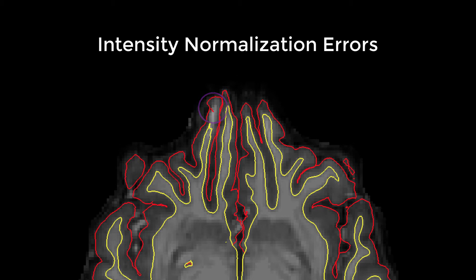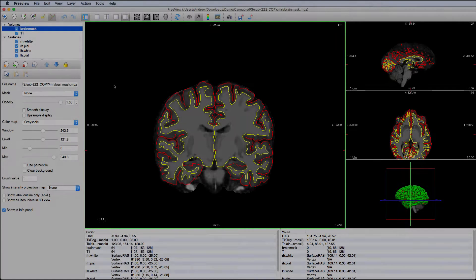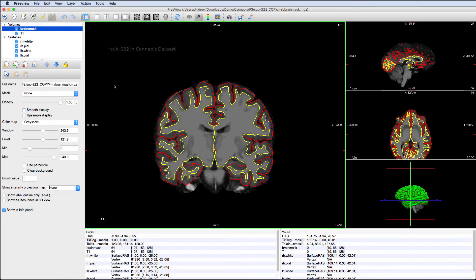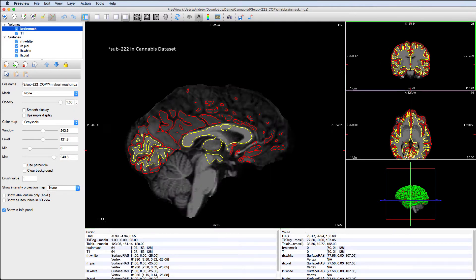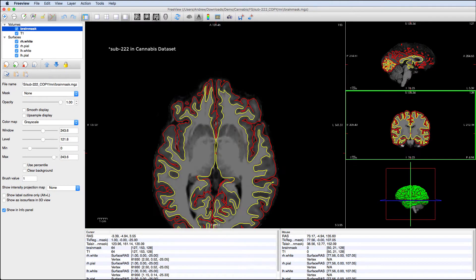To fix this, we will use control points, which boosts the intensity of the voxels surrounding the control point. You can find these errors in any viewing orientation, but I find it easiest to detect OFC and ventral temporal errors with the axial view.